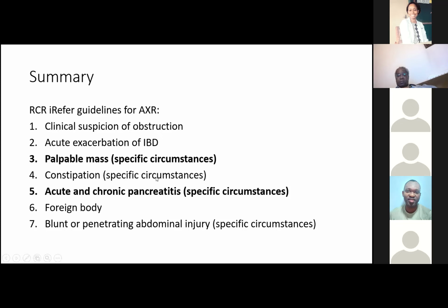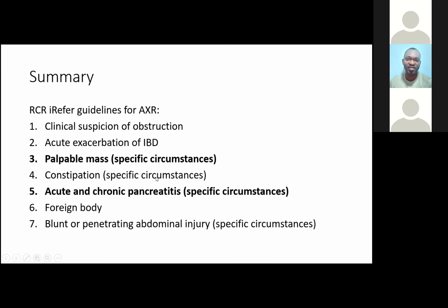Thank you. Yeah, that's a good question. Embarrassingly, I have to admit that's one I've not really thought about. When you've been doing this for many years, you end up doing it almost automatically. But one way of looking at it is to break it down into what's in the abdomen and pelvis. You have your hollow viscera, which is what we targeted today. So you almost want to take yourself on a journey from the stomach to the rectum and point out those structures. As I said, start in the upper quadrant.